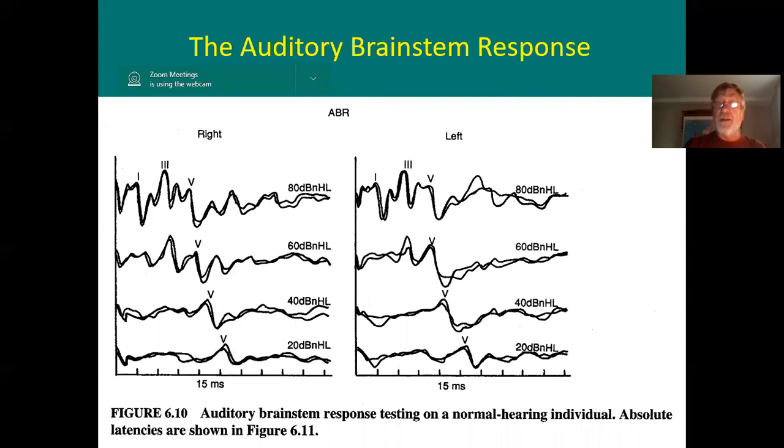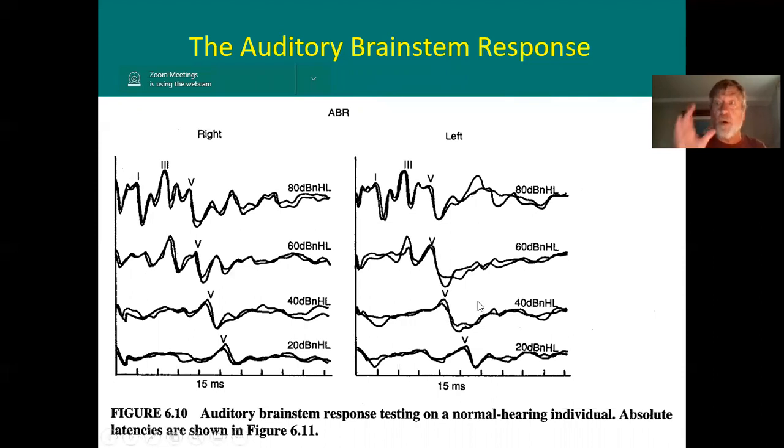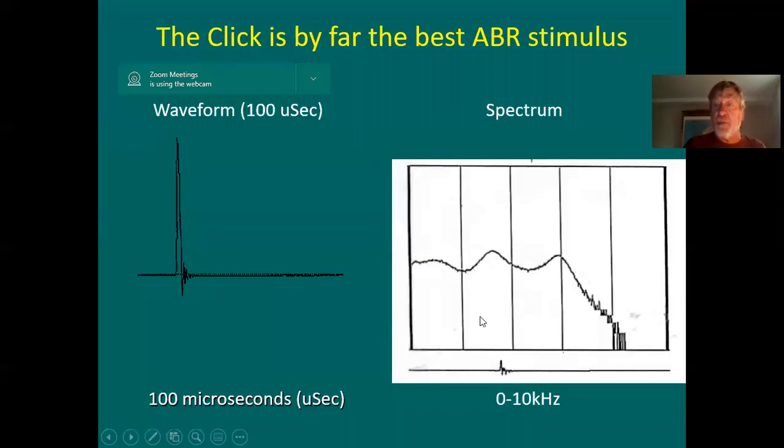Okay? Let's look at what happens now if you've got a tumor. So one application of doing the ABR is to test someone's hearing non-behaviorally, to find out what he hears. But the bad thing about it is you don't know at what frequency, because the clicks are so broad in their frequencies. So you don't know where the person's got normal hearing, but you do know he or she's got normal hearing somewhere in this range, because he's still got an ABR all the way down to 20.